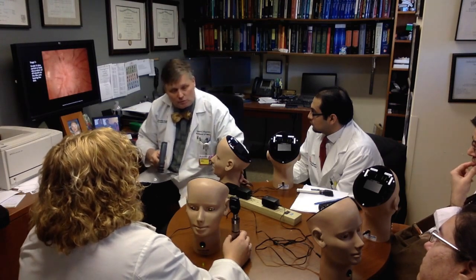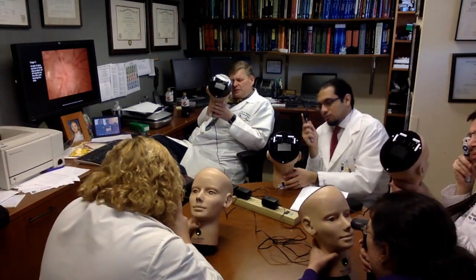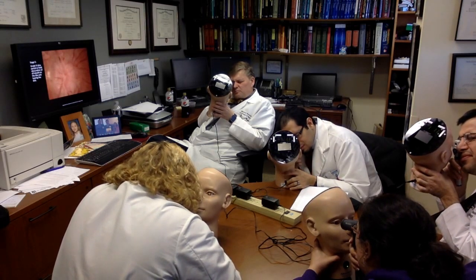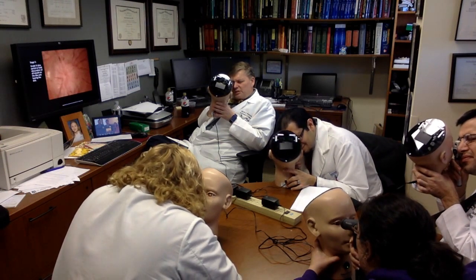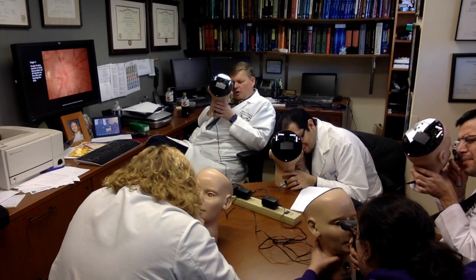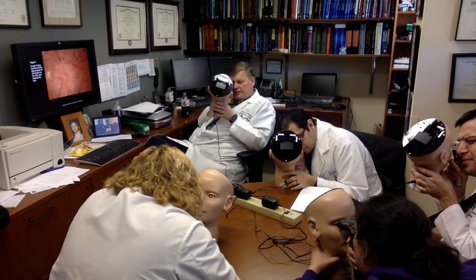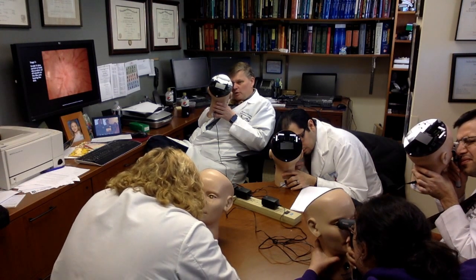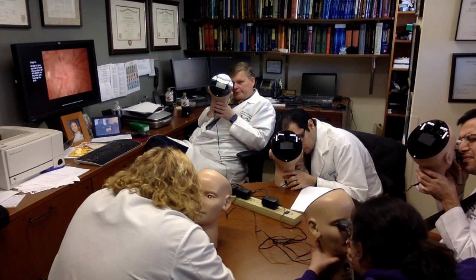Okay, so let's look at this one more time because it's so important. Go 10 feet away, focus in, come in at 15 degrees, get closer, closer, closer, then focus on your disc, and you notice that the veins are engorged and tortuous. You notice the physiologic cup has really been squished together. Then you'll notice that all the margins are blurred, up, down, left, and right. But very importantly, the optic nerve head is elevated, and you can prove that by seeing those veins and arteries run down the optic nerve head and then run out. Does everybody agree they see that?